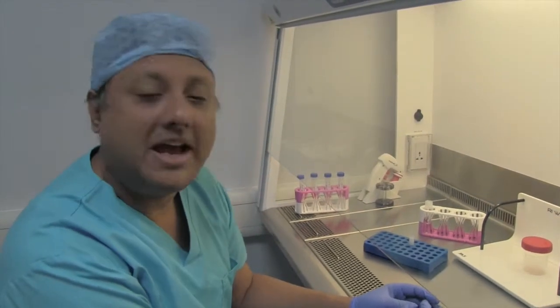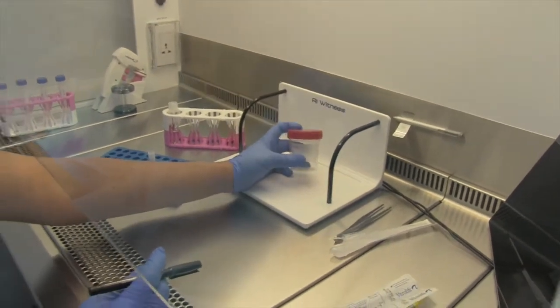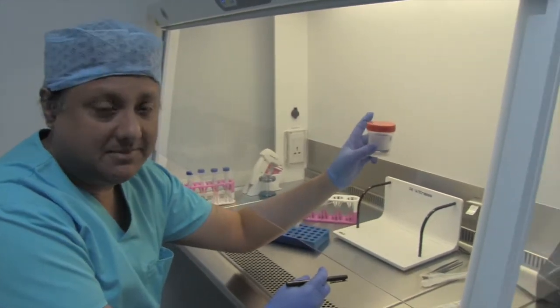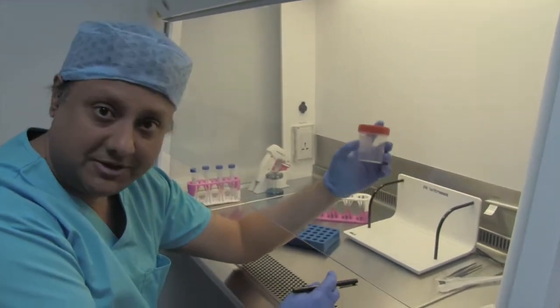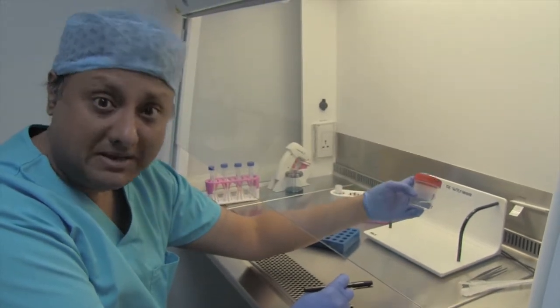Hello there. I'm now going to be showing you how to do a sperm freeze right from the time a sample is received in the laboratory. As I explained earlier in the video titled Sperm Preparation, you would get a sperm sample in one of these pots which is clearly labeled with the patient details — of course it will be the male's details.